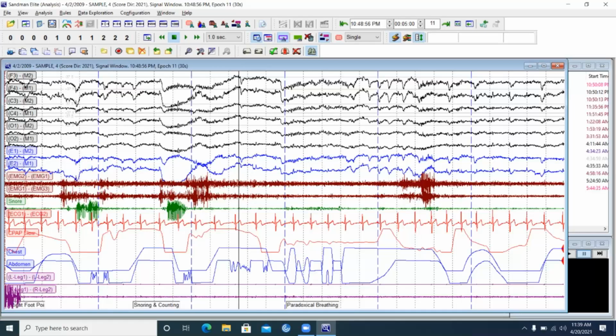The last thing we're going to do is one more exercise with breathing, which is having them hold their breath, but while they hold their breath, push your stomach in and out a few times. Essentially, pretend this is 10 seconds. So we have 10 seconds of no airflow. That's the definition of an apnea. Continued movement in the belts. So what kind of apnea is this mimicking?